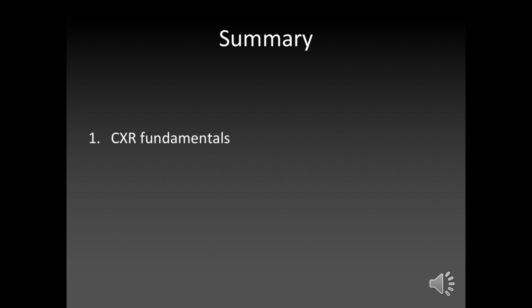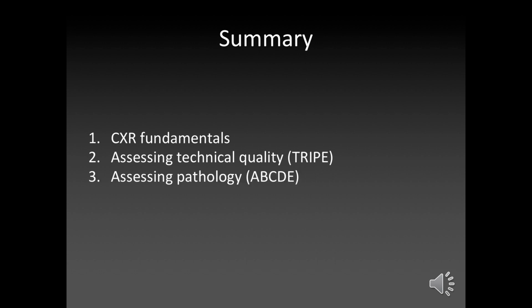The learning outcomes, at least back when I was at med school, are really vague on what you actually need to know about chest X-ray. It's just, as it is with many things, telling you to learn everything. So I think there are two important aspects, really. One is being able to assess the technical quality, and one is being able to assess pathology.